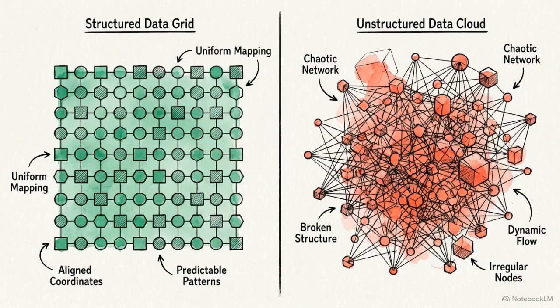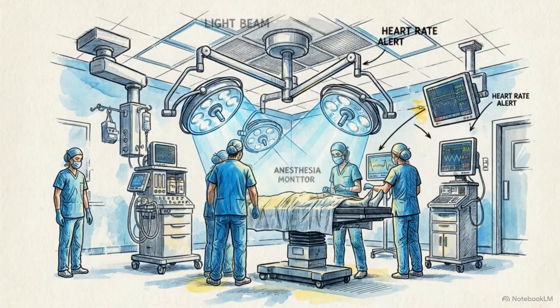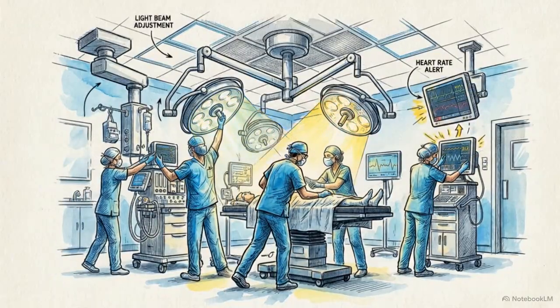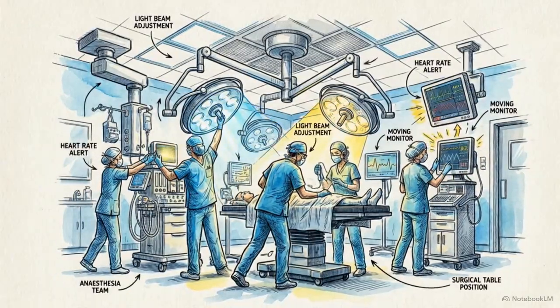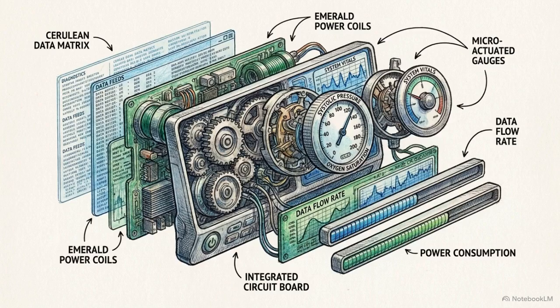When the statistical properties of the real world drift away from the data the model was trained on, the math breaks down. A model validated in a controlled laboratory setting will behave very differently after 6 months of exposure to the unpredictable variations of a live operating room. Securing patient safety in robotic surgery requires abandoning the assumption that validation is a one-time event. We have to build continuous mathematical observability directly into the surgical workflow.